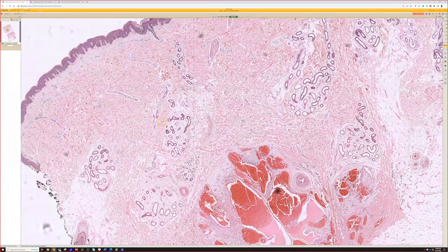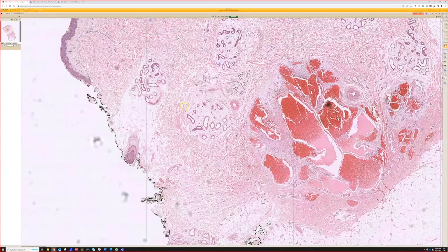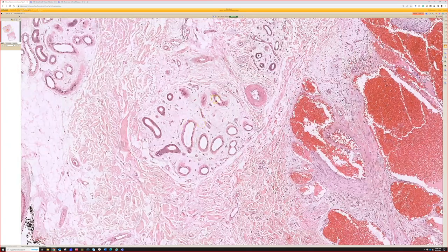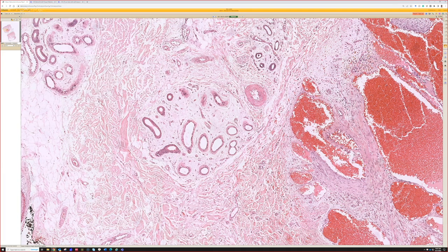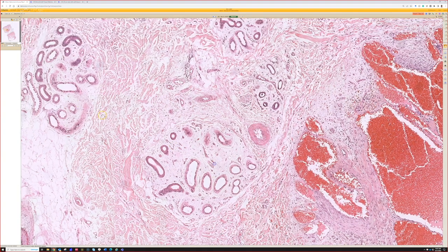I would like to take a moment to point out that this change around eccrine coils is kind of interesting, and I feel like I see this pretty often, particularly in the distal extremities. As you get close to the hands and feet, you often get abundant myxoid change or mucin in the stroma around the eccrine coil, and it kind of splays apart and dilates the space the coil takes up and pushes each individual tubule apart from each other.